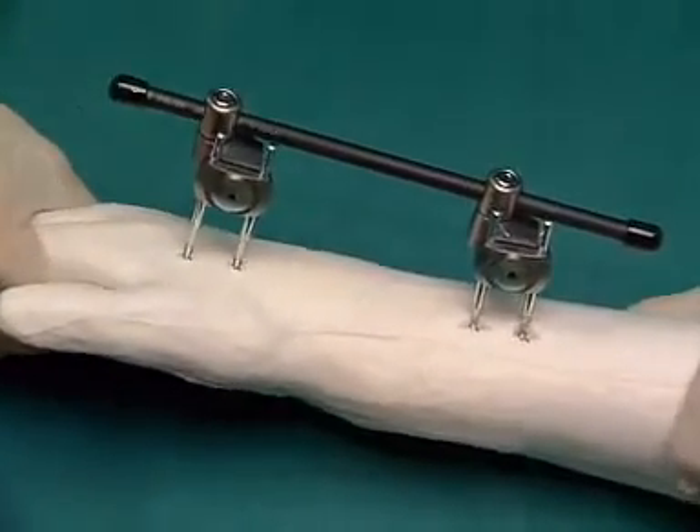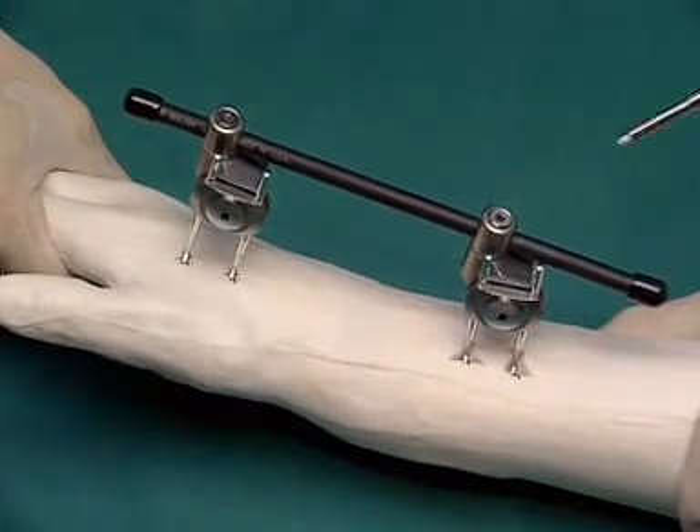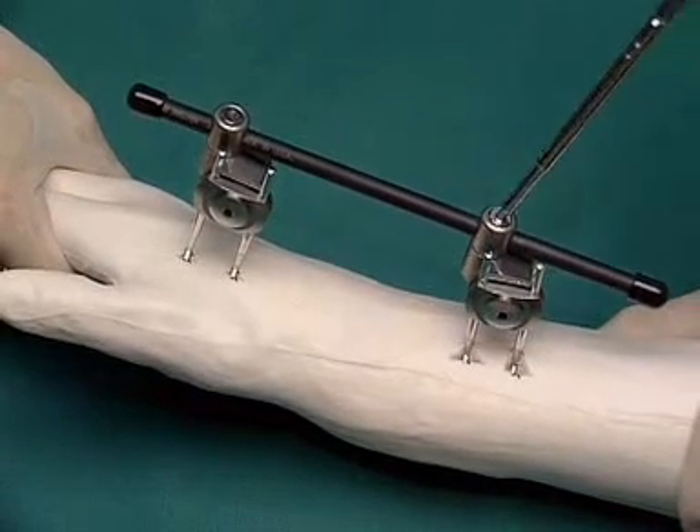Under image intensifier control, the fracture can now be reduced and the position fixed by firmly tightening all screws.